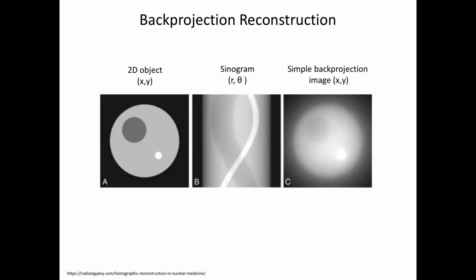And so as I move, I'll see at certain angles, for example, say this angle along here, when the detector's set here, this object and this object will be completely overlapped. I'll be right there, right? When my detector has the L direction along here, or in this case, R, sorry, L and R are gonna flip around a bit. So I have my detector along here, this projects down, that's when they're the farthest apart here.